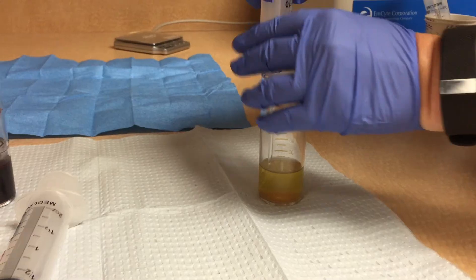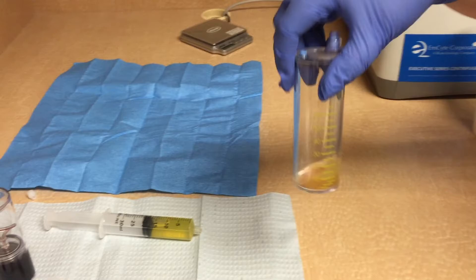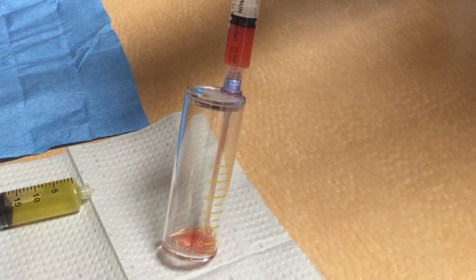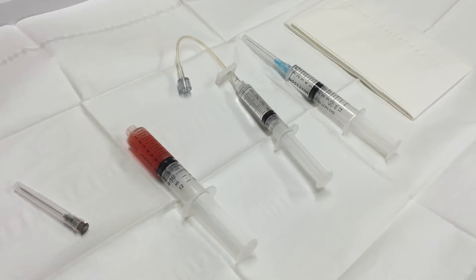This sample I was attempting to get a leukocyte-poor sample, and this was about as good as it got. You can see from this final product we have a significant amount of red blood cells left in the sample.